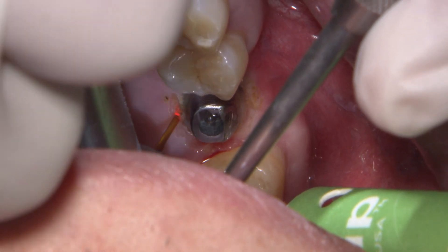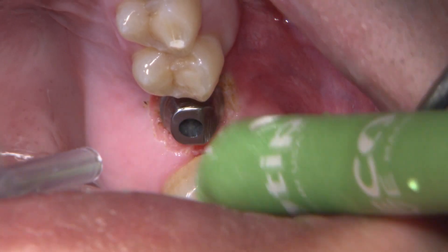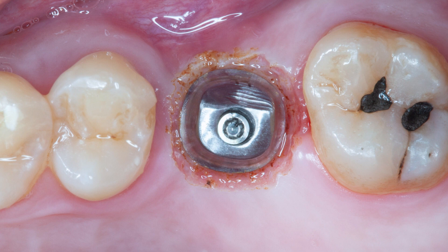What we often see in the lab is when restoring implants, the margins are often buried very deep below the soft tissue, especially with stock abutments since there's no way to control the depth of the margins. Surgical intervention may be necessary for these deeply set margins.